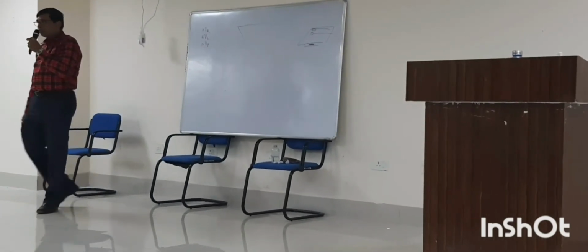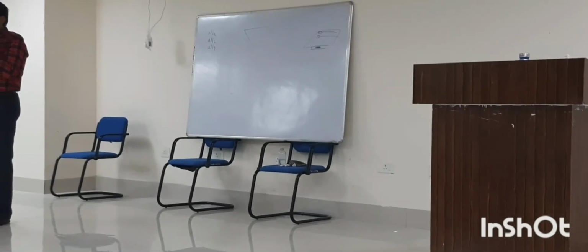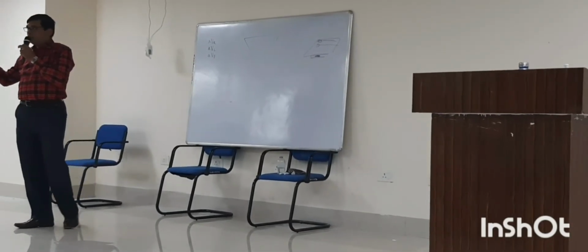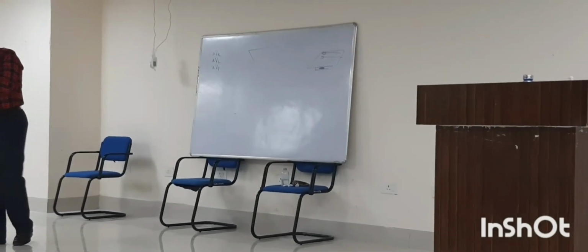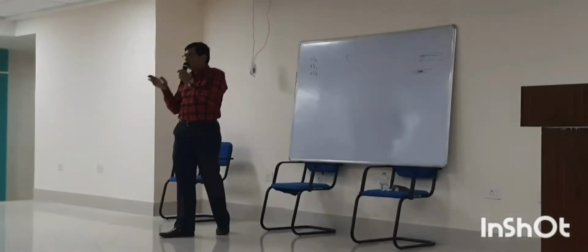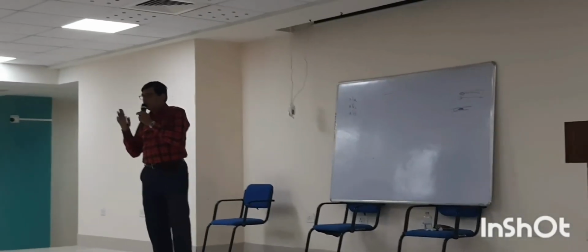Augmentation can be done by attaching three resistances of 5000 ohm at the respective leads, and the other ends are connected to a common terminal called the Wilson central terminal. The resistances are attached in such a manner that they are directed as a bisector of the angle of the equilateral triangle.